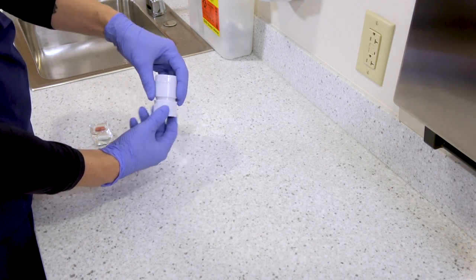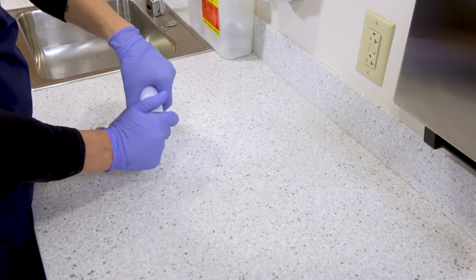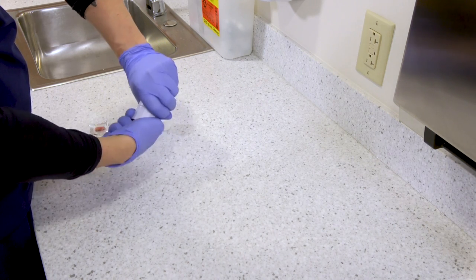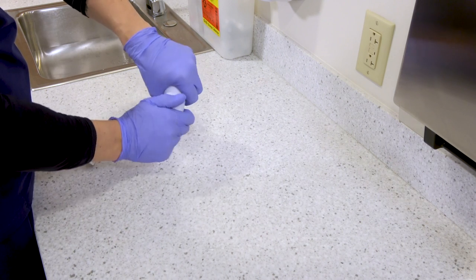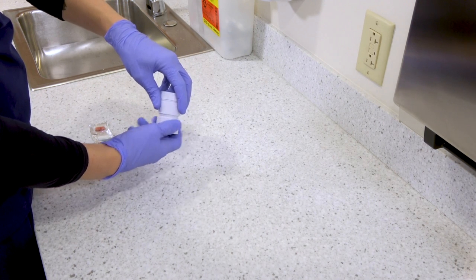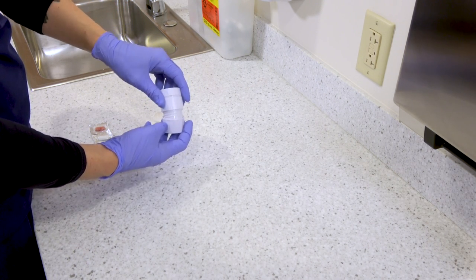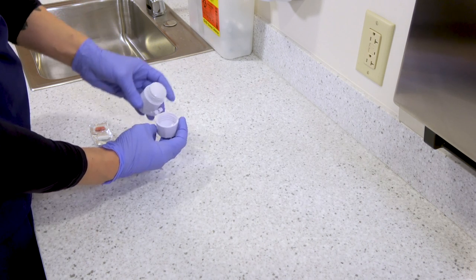Twist it closed and you'll have to twist past resistance—that's just the pill breaking. Twist it back and forth a few times to make sure the pill is fully crushed and you've got a nice fine powder. Open the crusher, tap the lid a few times to remove residue, and transfer the powder into a medicine cup.